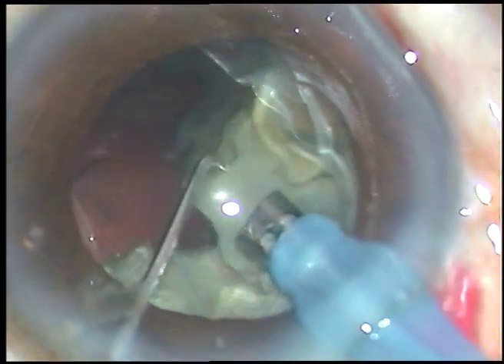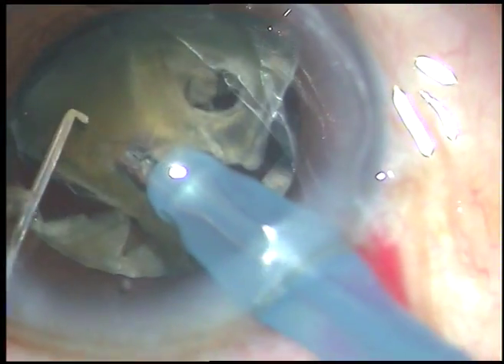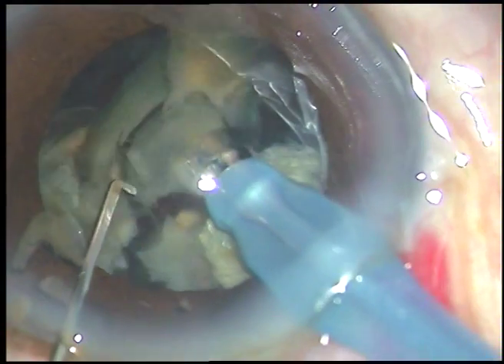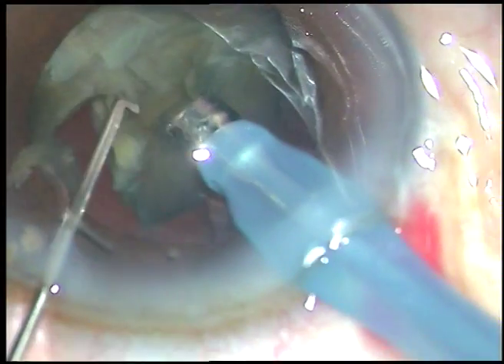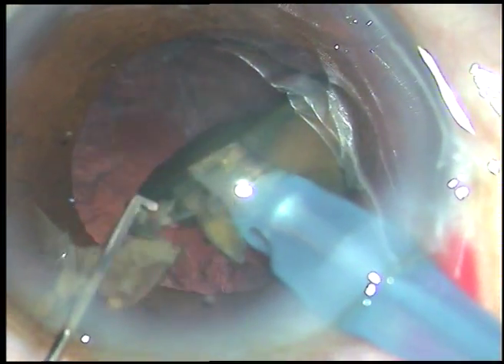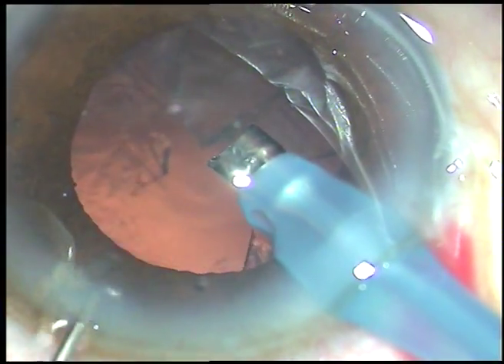Each fragment is being emulsified applying ultrasonic energy and removed. Ultrasonic power used in this case is 70 percent, flow rate is 45 ml per minute, and vacuum is 450 mmHg. Now we are towards the end of nucleus management — these are the last few bits. I remove the chopper to make the anterior chamber more stable, and as I do so, leakage from the side port stops.